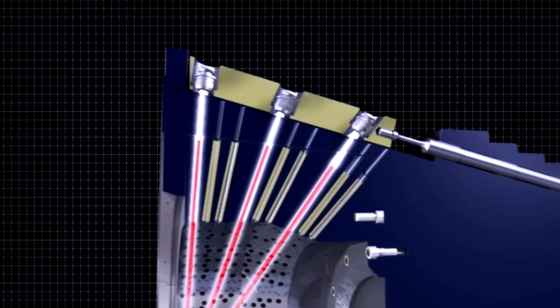So many patients have surgery, neurosurgery for brain metastases, and it's quite distressing. As a radiation oncologist, I know that patients have their breast cancer treated, for example, and they may have spots in the brain. What's the advantage of, say, gamma knife over surgery? Well, it's all case by case dependent, but generally it's a non-invasive procedure. That's one of the major things.